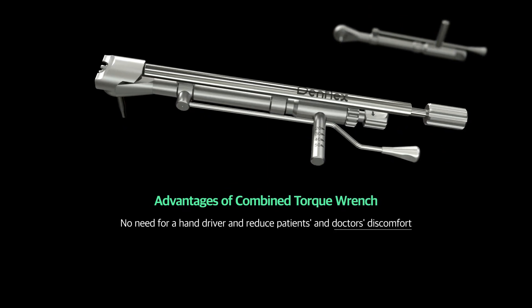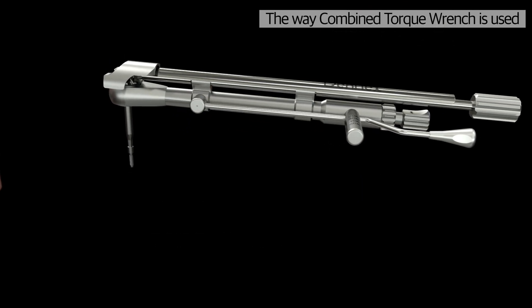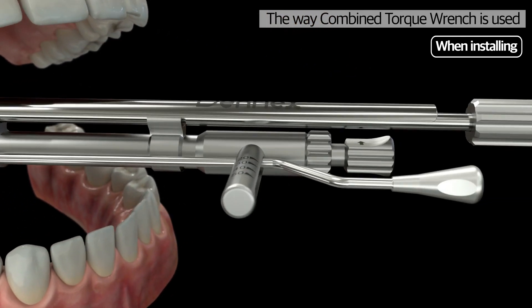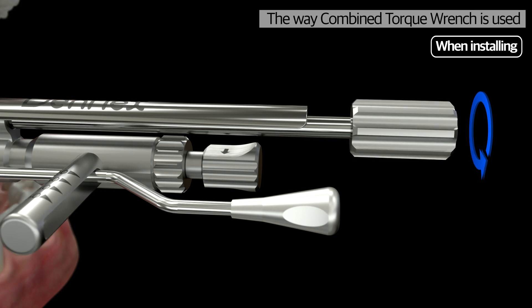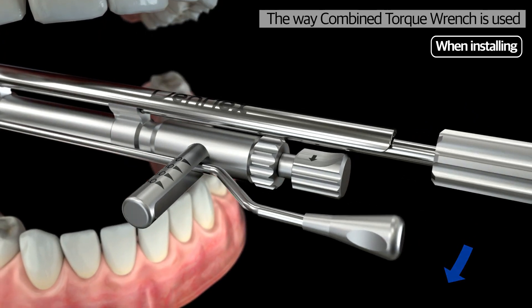DenFlex's Combined Torque Wrench reduces these problems with an innovative solution. Primary installation of the screw and binding can be done with one piece of equipment, which eliminates the need of putting a hand in the mouth of a patient. The process of binding the screw with the handle and finishing the job with the torque bar can be done with one equipment.